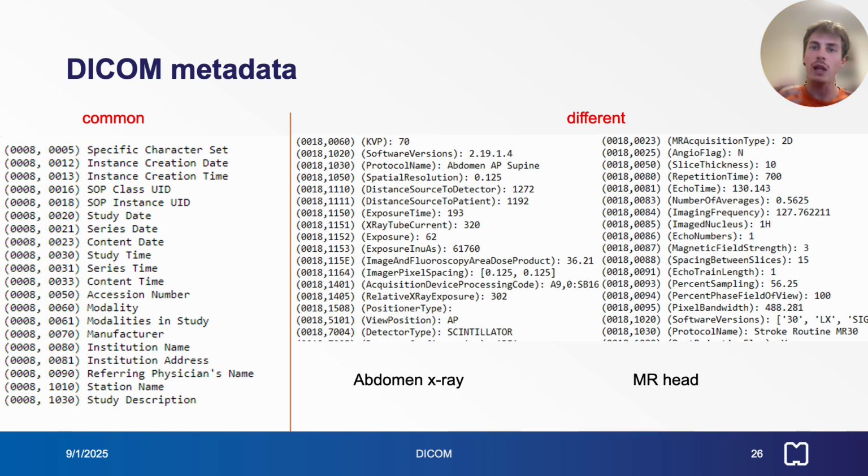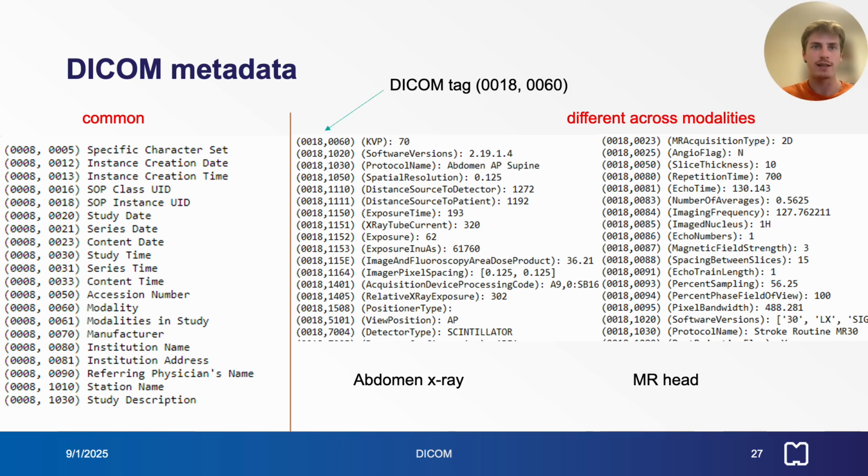The intent is that a single image may be separated from other images of the system on which it's produced or stored, yet still contain a full set of information necessary to identify and interpret it. DICOM datasets encode information as data elements, each identified by a unique 32-bit tag and a predefined value representation. Pixel data is treated as another data element without a fixed header or specific dataset order, which requires full parsing to reliably extract the information from a DICOM file.